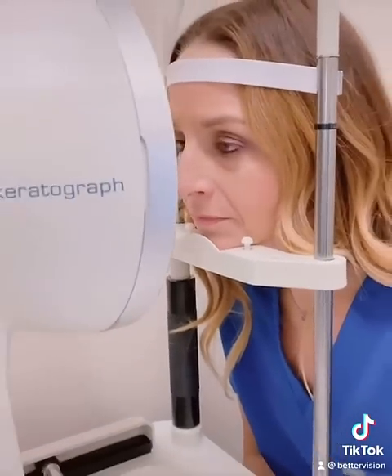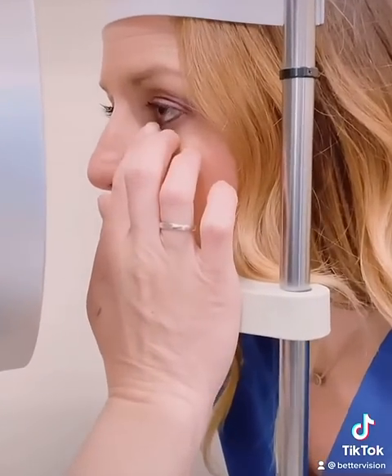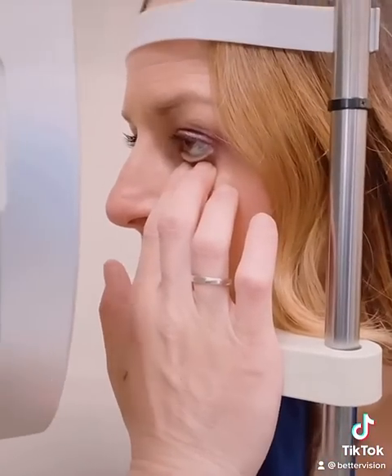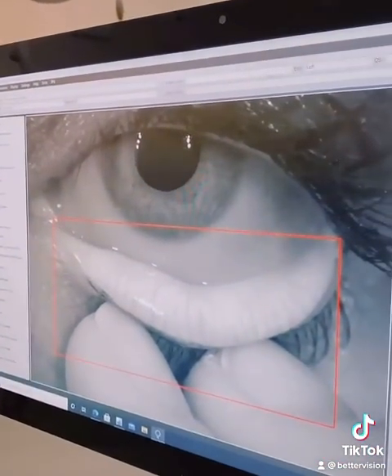After the patient places their chin in the machine, the staff member is then going to pull down the lower lid. This is going to expose the oil glands in the lower lid. She pushes a button, takes a picture, and as you can see here on the screen, here are the oil glands, or meibomian glands.